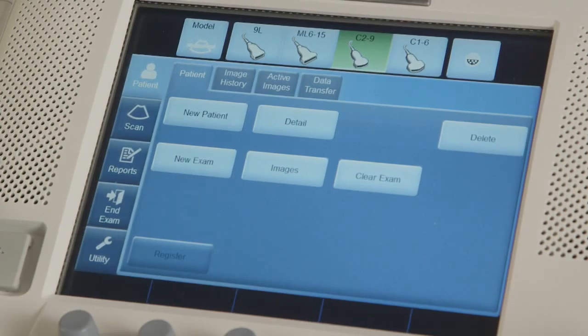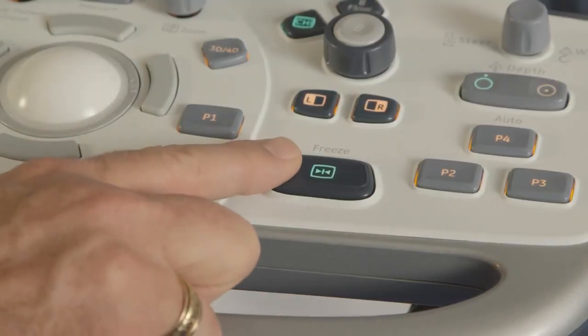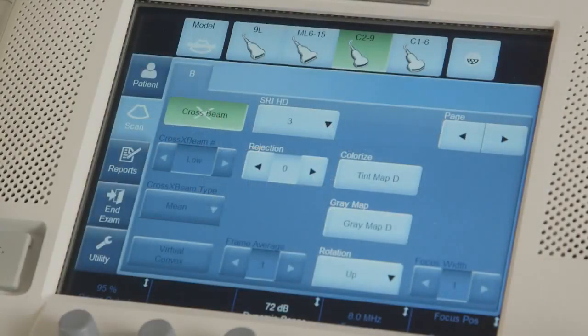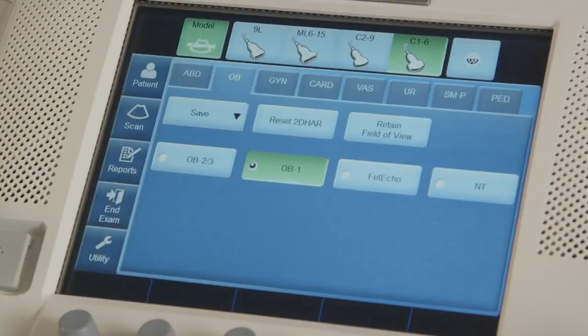On the Expert Series, to enter patient exam information into the system, press the soft key on the touch screen located on the upper left-hand side, just below the model key. If worklist is not set up, enter patient ID by setting the cursor inside the patient ID field and typing in the appropriate number, last name, first name, etc. Underneath patient information, select the appropriate category type, for example, abdomen, OB, vascular, etc.